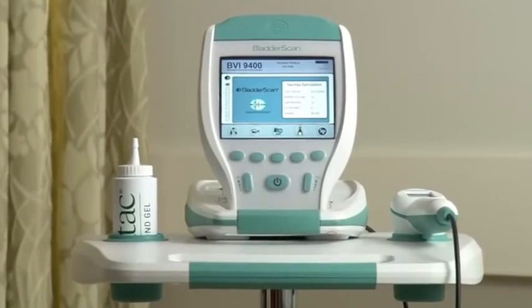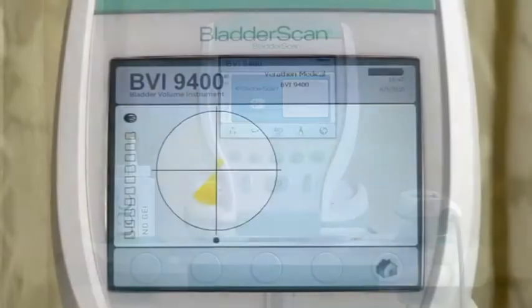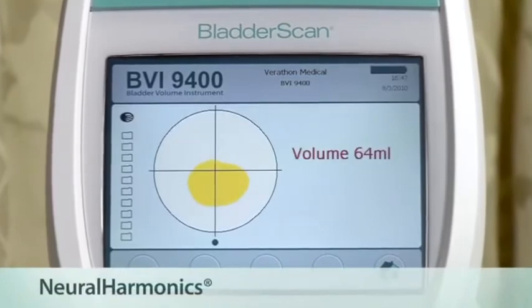Today I want to introduce the Bladder Scan BVI9400, a bladder volume instrument with neuroharmonics technology.